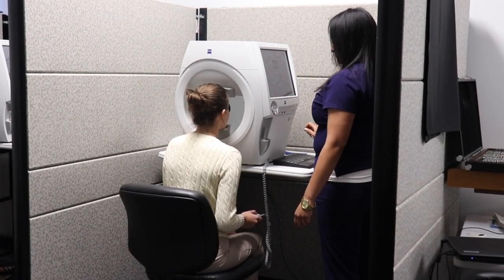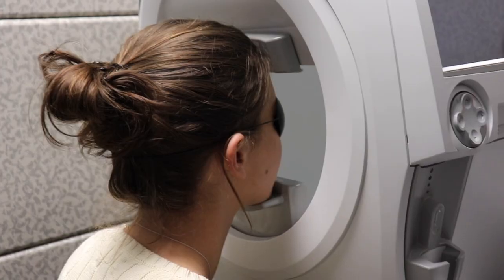A visual field test is a way to assess a patient's full field of vision, both their central vision as well as their peripheral vision. We predominantly do it for patients who have a condition called glaucoma. Glaucoma is a condition that affects your optic nerve, and for most patients in the early stages it affects your peripheral vision, so a visual field test is one of the best ways to be able to assess for that.